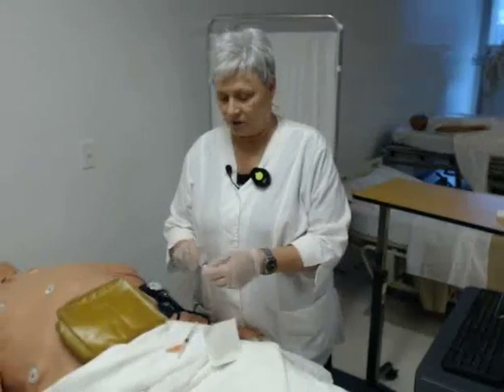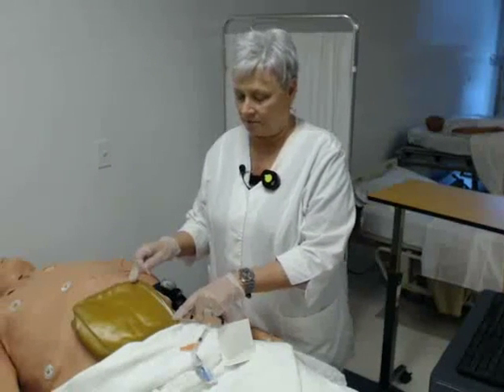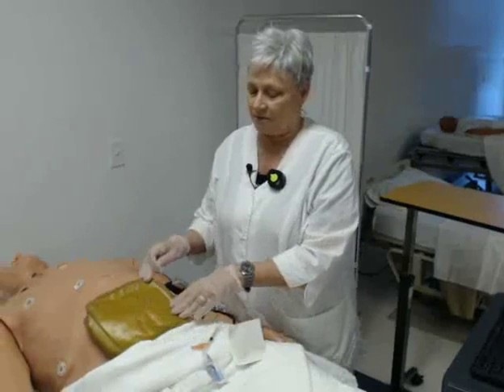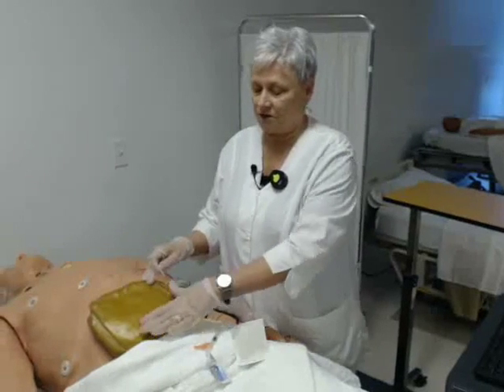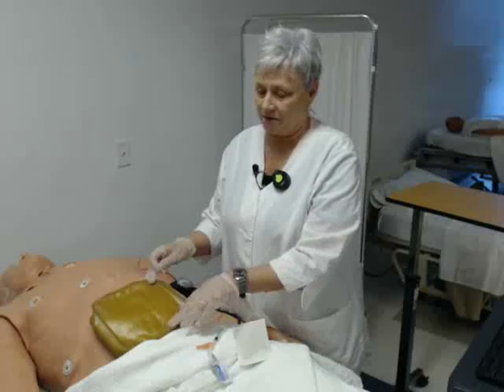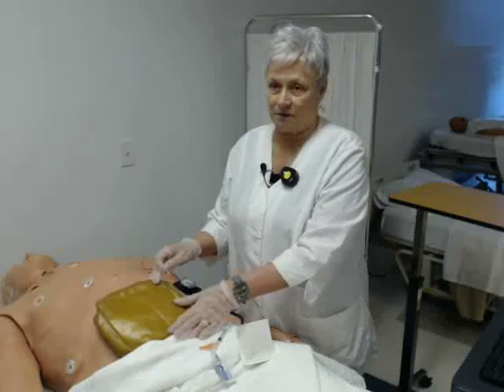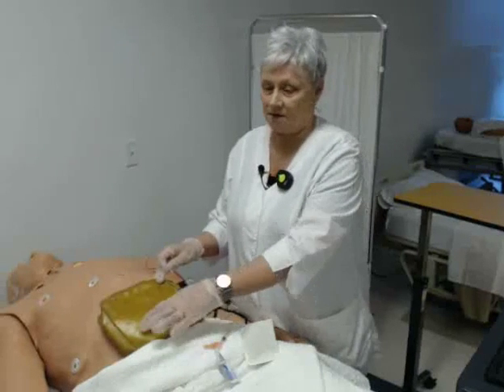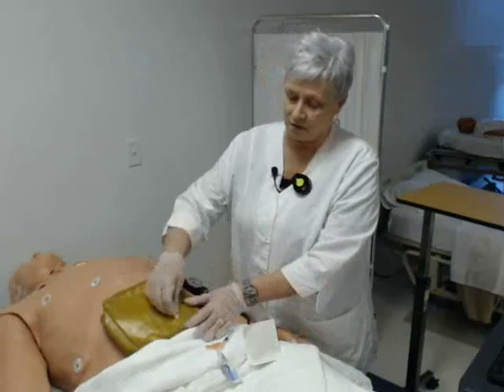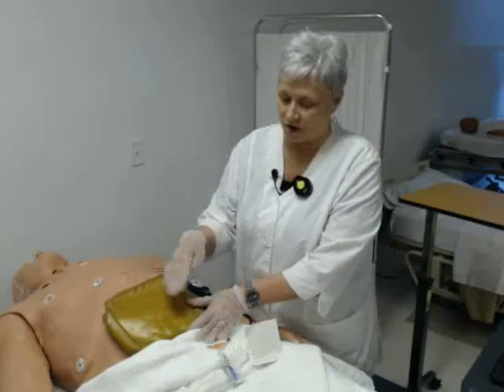I'm going to give it in the abdomen because that's where we give anticoagulants generally, and I'm going to use my landmarks that are indicated, which is two inches or two finger widths around the umbilicus. So I'm going to look for a spot that isn't bruised, because sometimes we see bruised spots in patients getting anticoagulants. So I'm going to clean my area with my alcohol prep pad and let it dry for a little bit.